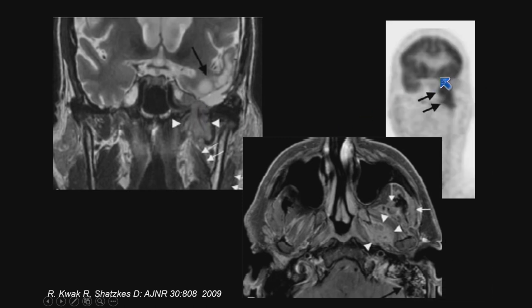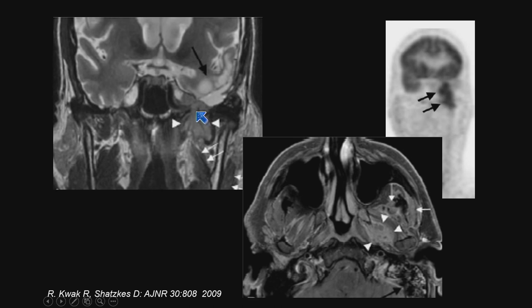You can see the lesion is an intracranial tumor which has actually extended or invaded the extracranial compartment — in this case, the masticator space. You can see the trigeminal cistern, or Meckel's cave, normal on the right, invaded on the left, adjacent to the foramen ovale.